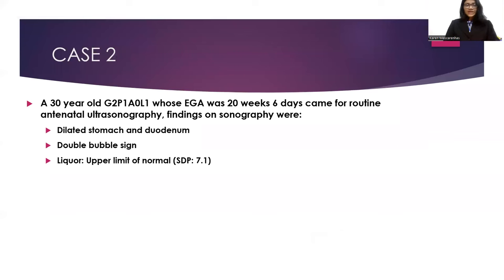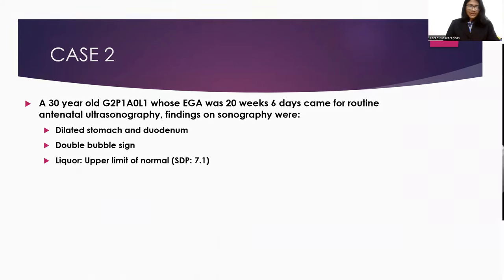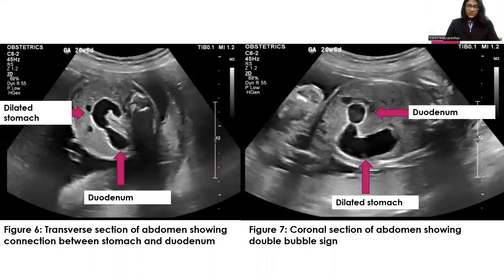My second case: a 30-year-old G2P1A0L1 with an estimated gestational age of 20 weeks and 6 days came for routine antenatal ultrasonography. Findings were a dilated stomach and duodenum giving the double bubble sign, and liquor in the upper limit of normal with a single deepest pocket of 7.1 cm. Images show a transverse section of the abdomen and a coronal section demonstrating the dilated stomach and duodenum giving the double bubble sign.